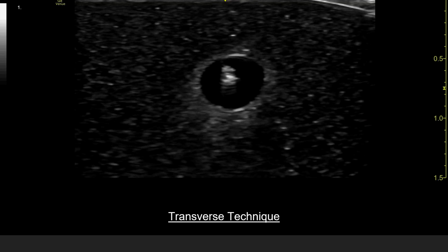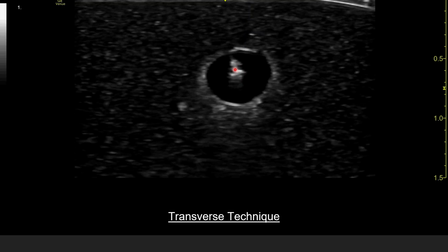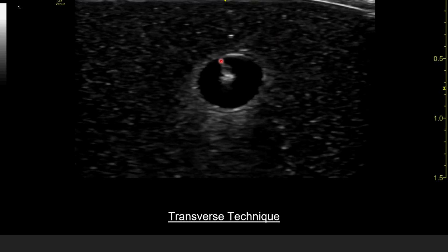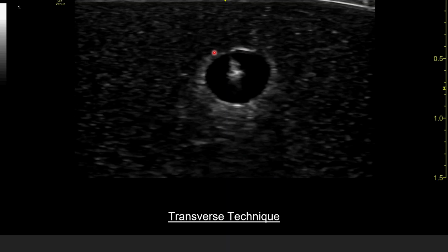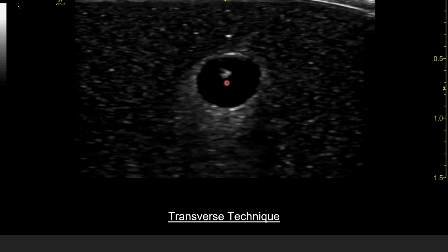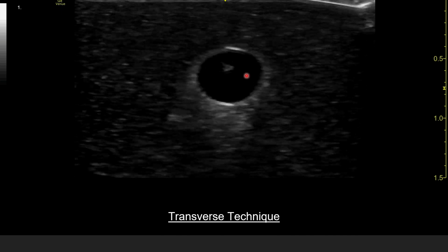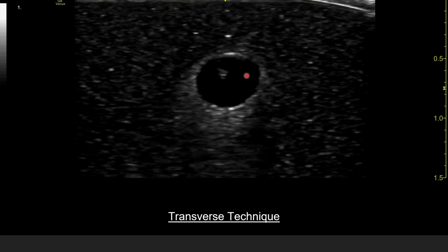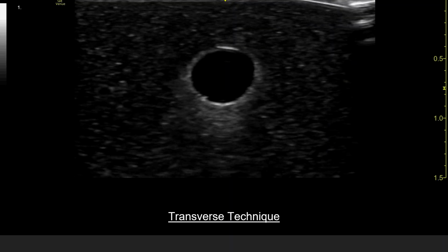So what you'll see on this GIF is I've got my vessel lumen, and you keep seeing this bright white echogenic focus. That's just the needle tip, and I promise you I'm not just bouncing in the vessel lumen. What I'm doing is with each view, I'm moving my needle tip into my view and centering the vessel. Then I'm sliding down, losing that needle tip view, and I keep progressing where I see needle tip, lose it, bring needle tip into view, slide forward, bring needle tip into view. It's a good way you can actually almost walk that entire finder needle into the vessel, and just make sure when you pass the wire that all that wire will travel within the vessel, so you'll have a successful catheter placement when you get ready to finish the procedure.